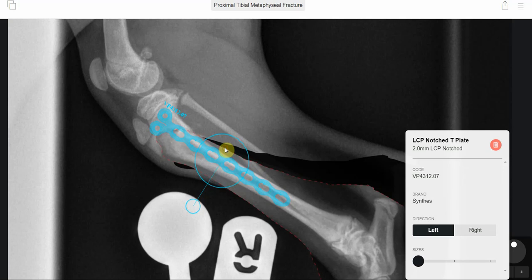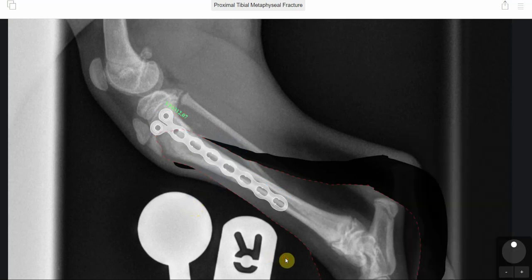As can be seen here, we can just about get three little screws above and then further down into the shaft of the tibia. So that was our plan.